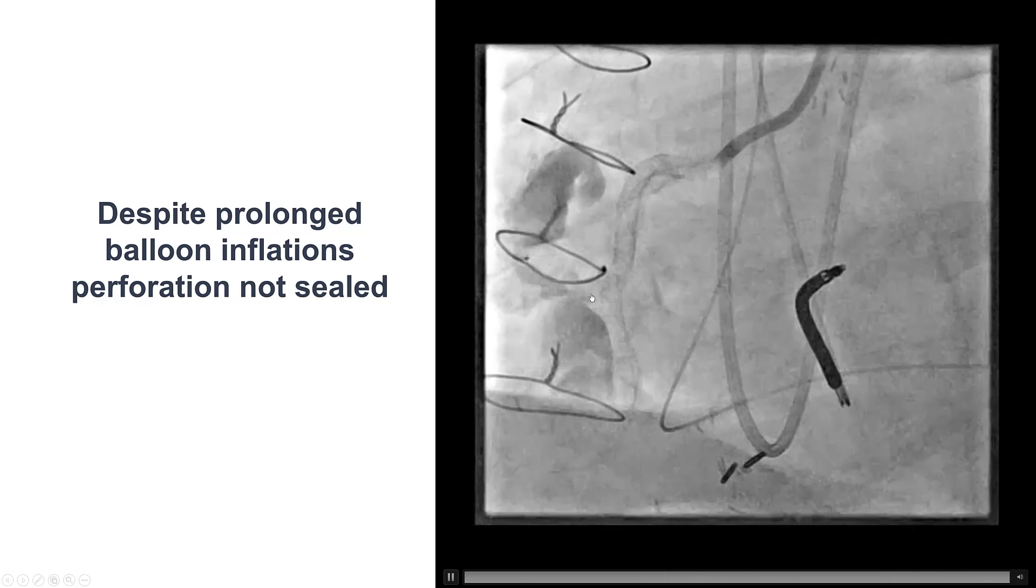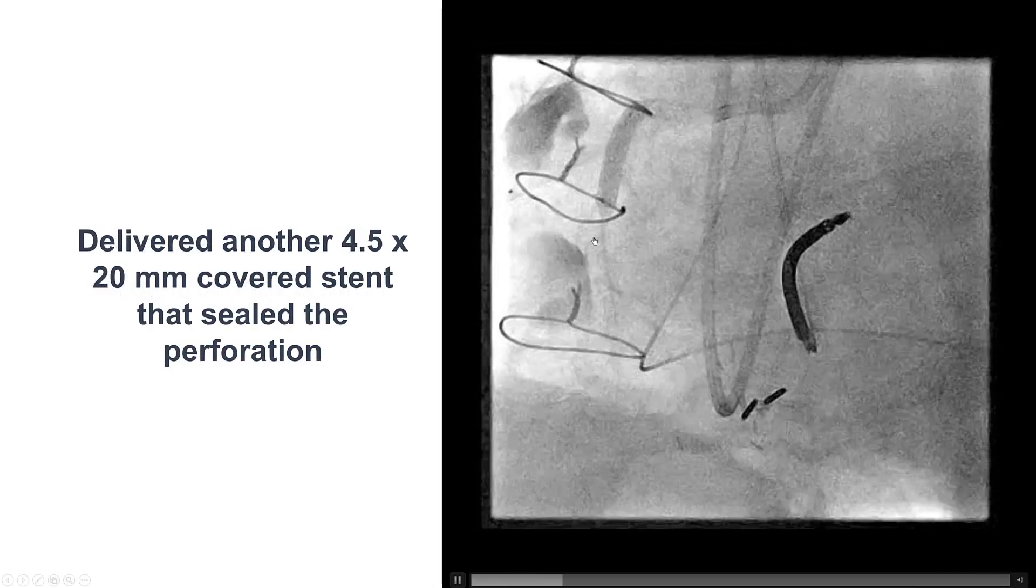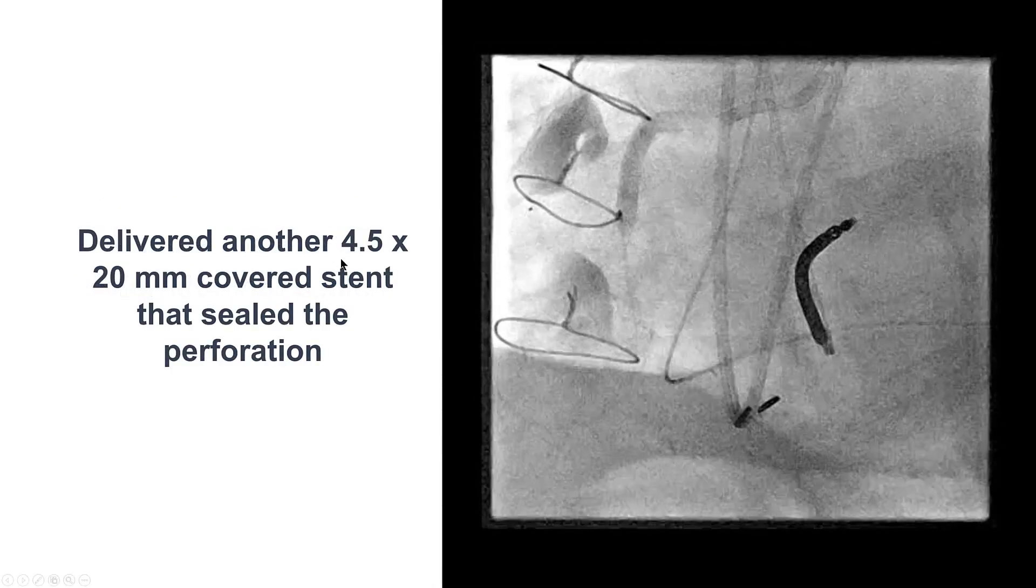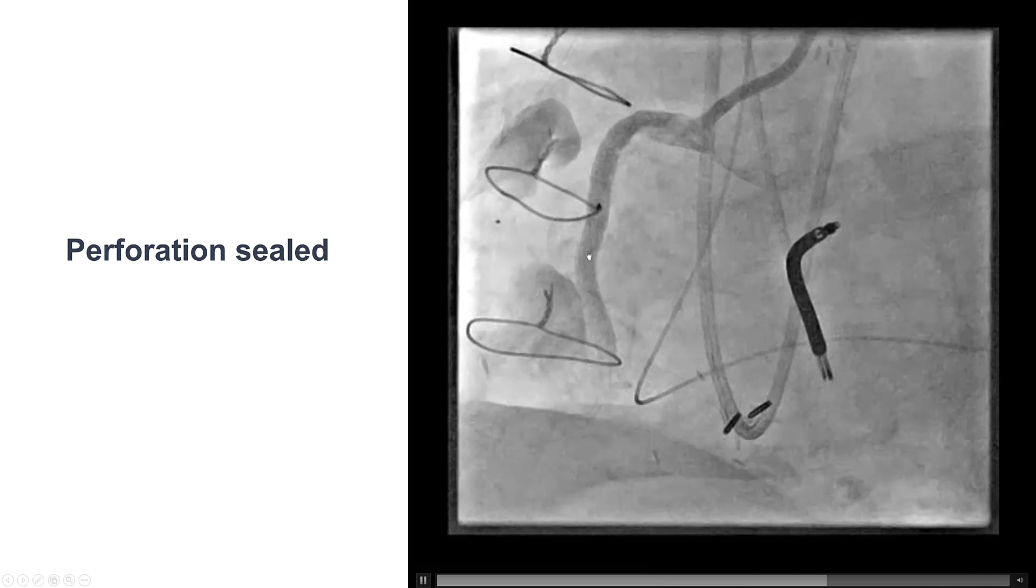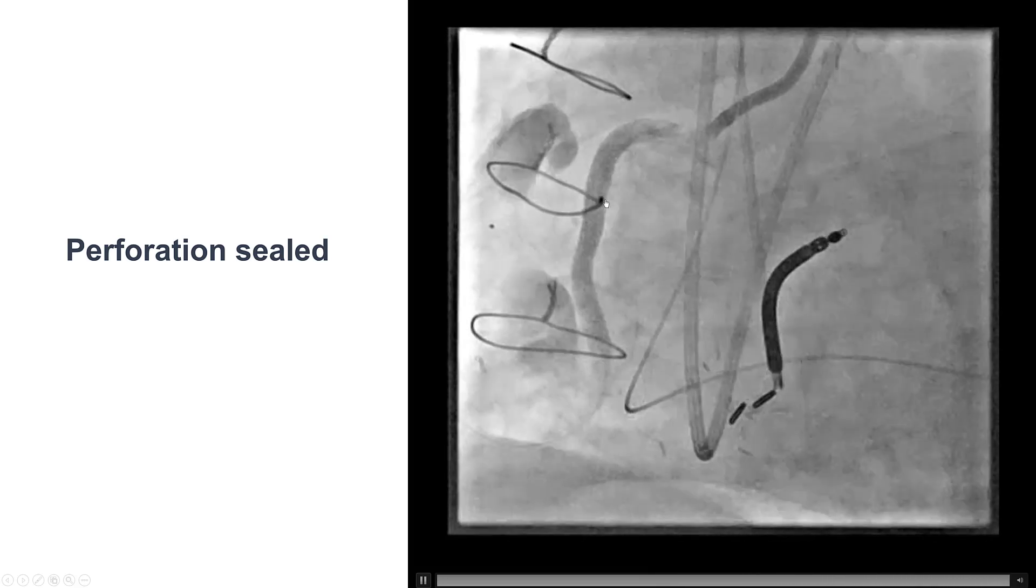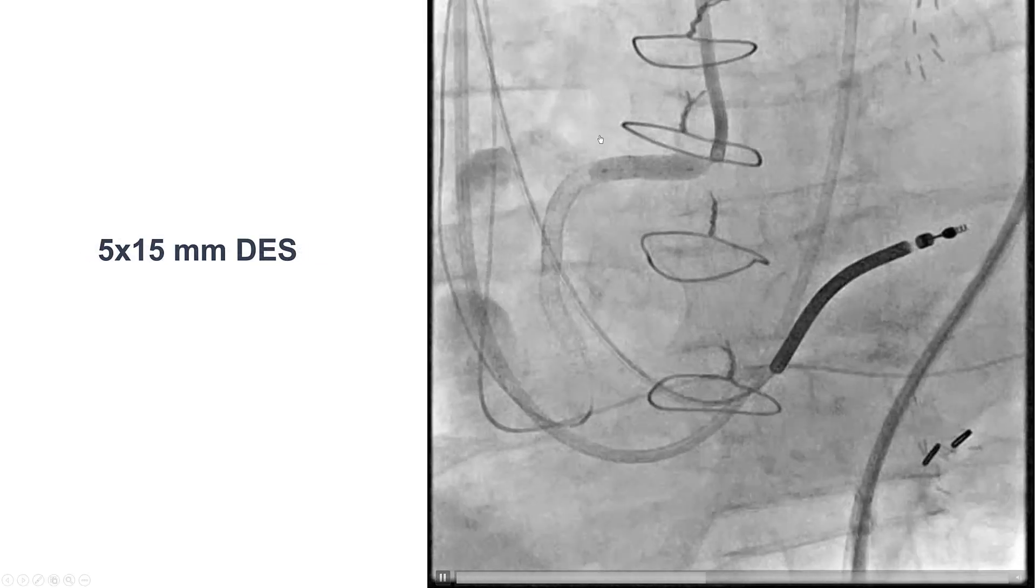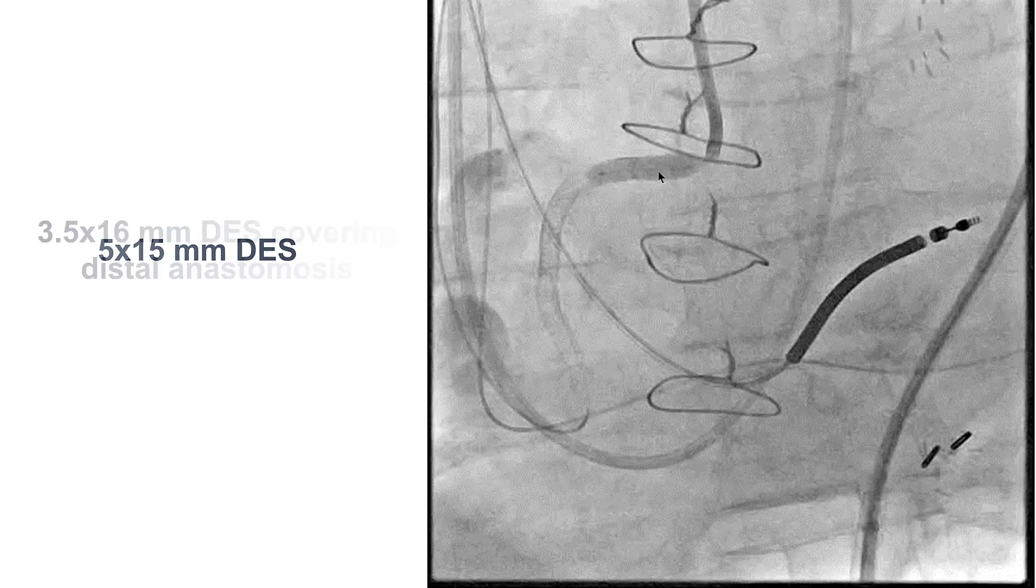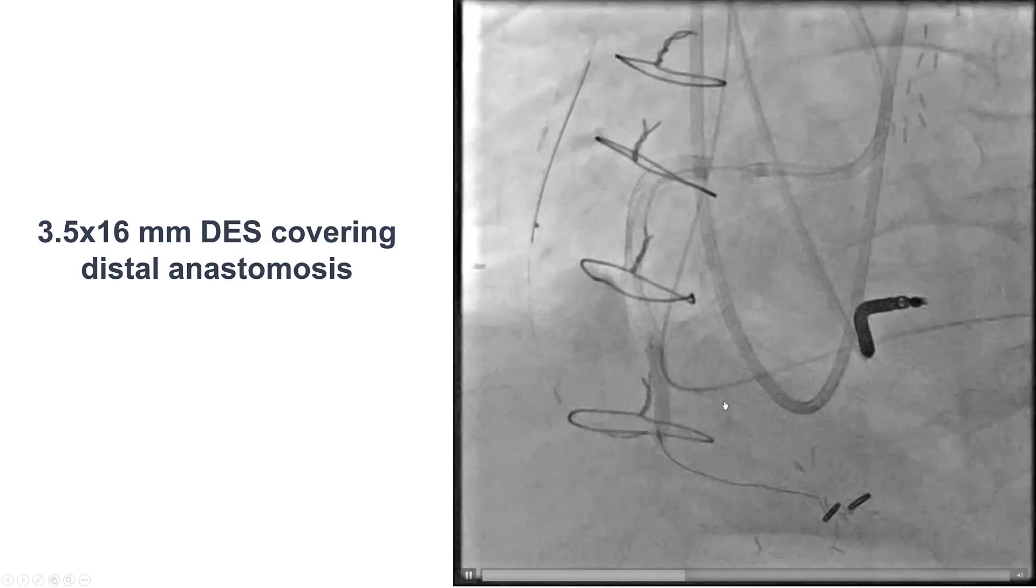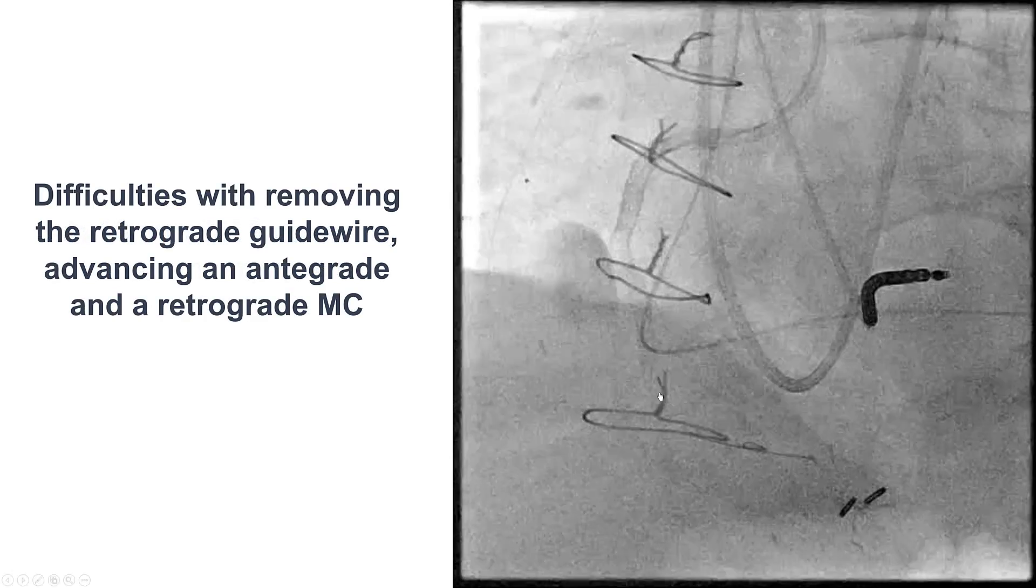Unfortunately, we still had bleeding through the coronary artery, and we ended up using another covered stent, 4.5 by 20 millimeters, that eventually achieved hemostasis, sealed the perforation. The patient did remain hemodynamically stable through this, and then we finally finished by placing an additional drug-eluting stent to the proximal right coronary artery. There was some disease distally, so we placed another drug-eluting stent distally.